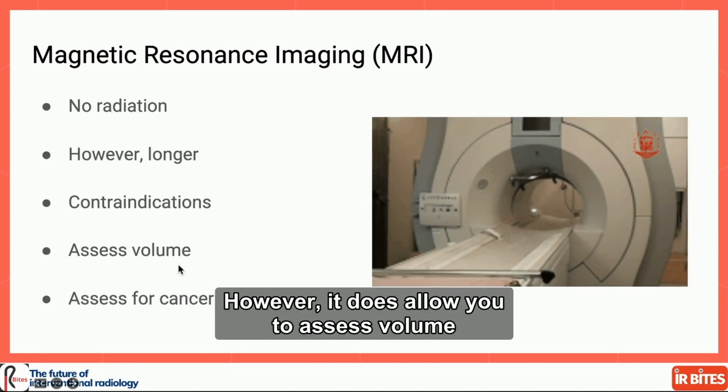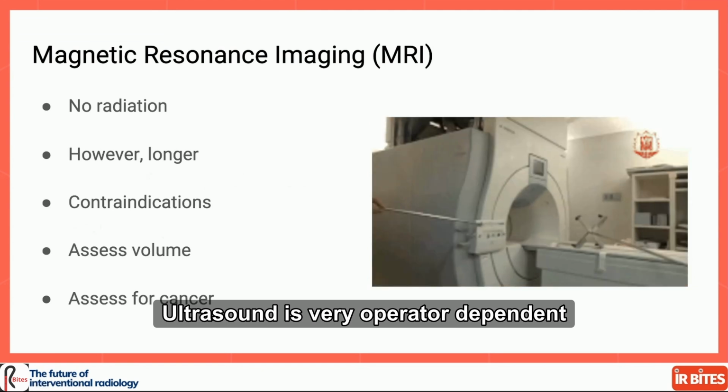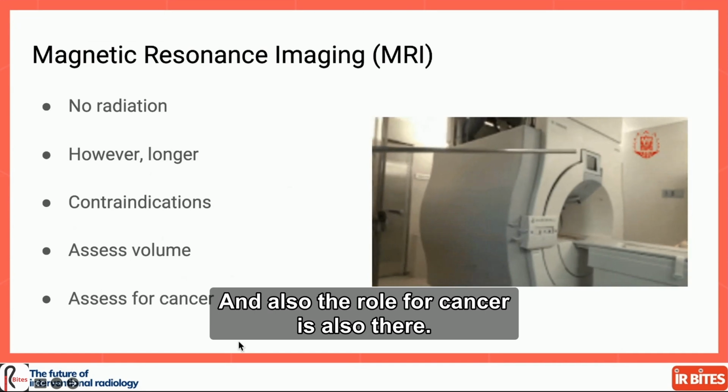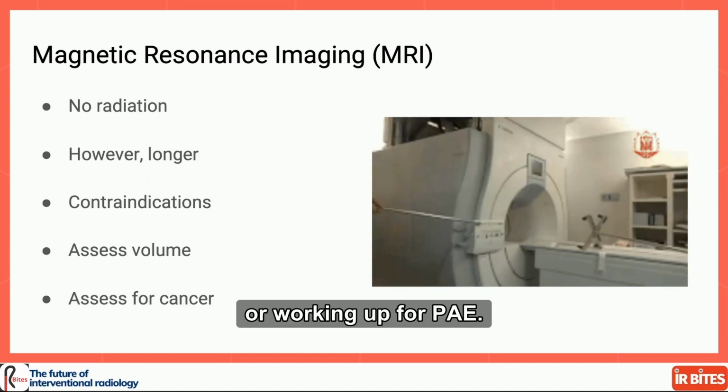However, it does allow you to assess volume quite accurately. Ultrasound is very operator dependent and can be quite subjective. And also the role for cancer assessment is there. So it's an important tool in the workup of a patient with BPH, or working up for PAE.